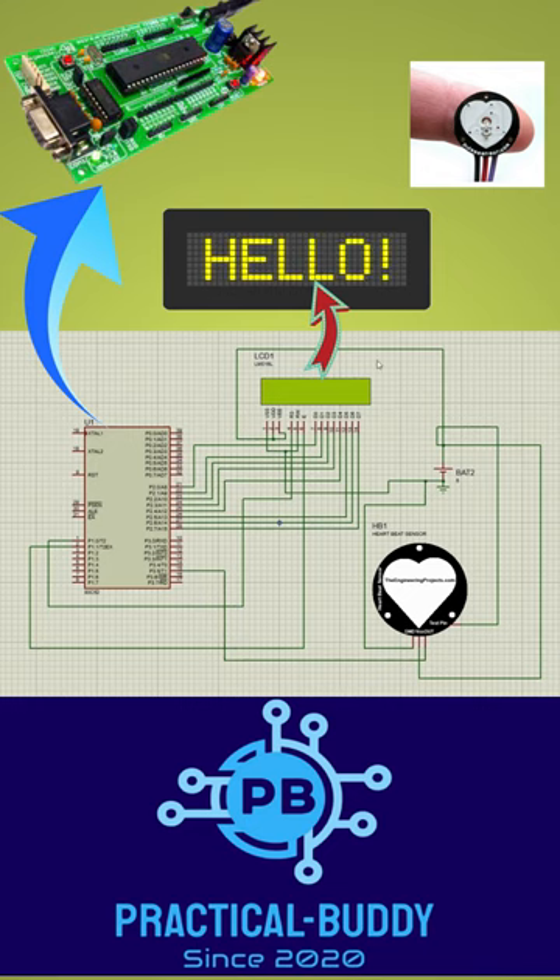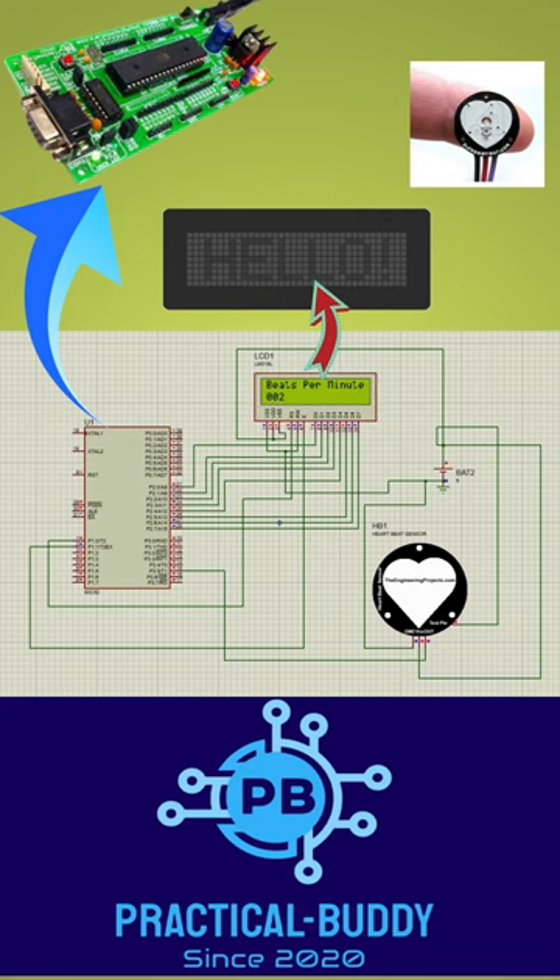Hello engineers, welcome to this short video. In this video we are going to simulate the project that is an 8051-based heart monitoring system. Let me run this particular circuit on the Proteus software.